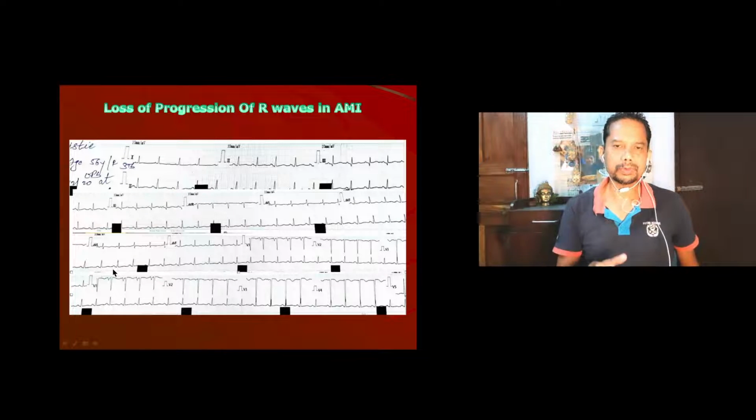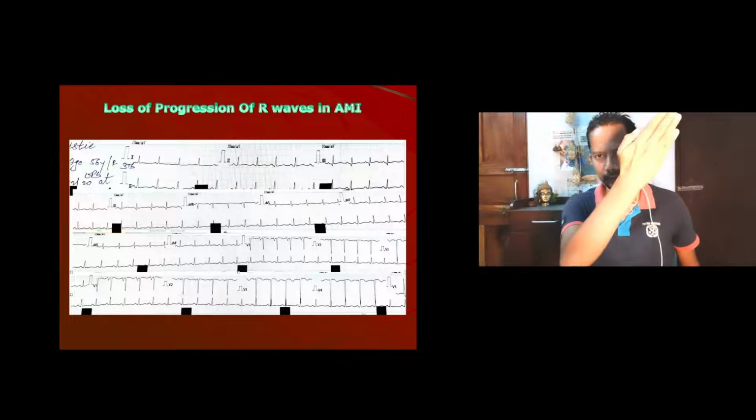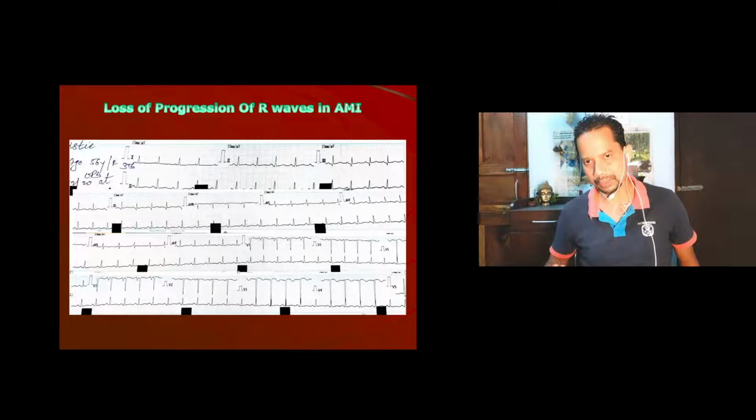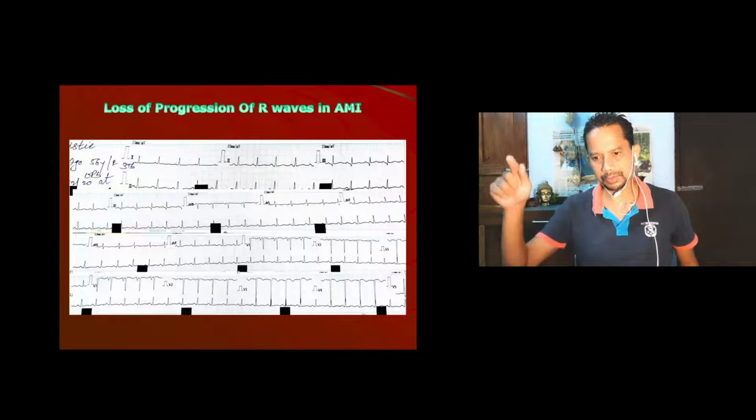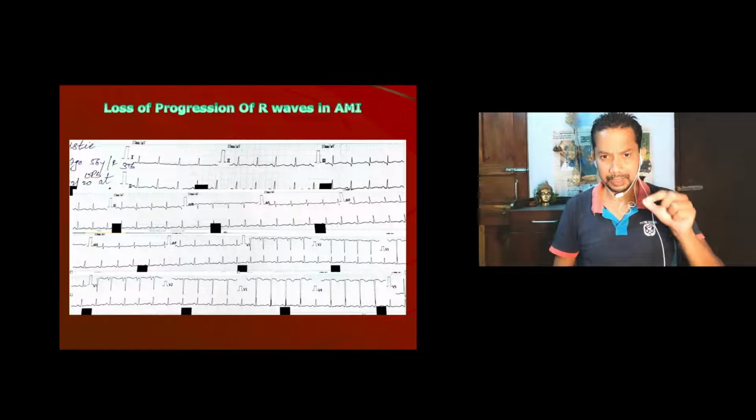Whenever you have to study or comment on the P wave, you see lead 2, because the current is coming straight from the SA node towards lead 2, you will get a good size P wave, good size QRS complex, good size T wave. In V1 you see the P wave is biphasic. There is a very small positive wave in the P, that is because of the right atrium.